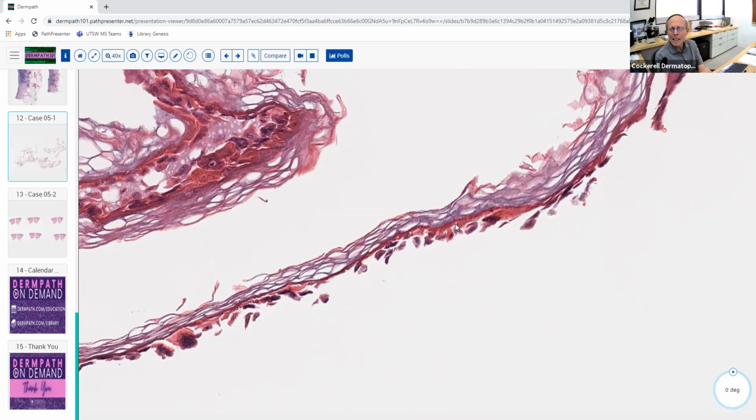They're bringing out a frozen section. Pemphigus can give you acantholysis like this. Absolutely. Well, TEN is the other one. So TEN, Stevens-Johnson is one. That's the same thing. EM, Stevens-Johnson, TEN are all in the same family. So that's one entity. The other is the entity that you don't have to worry about as much.